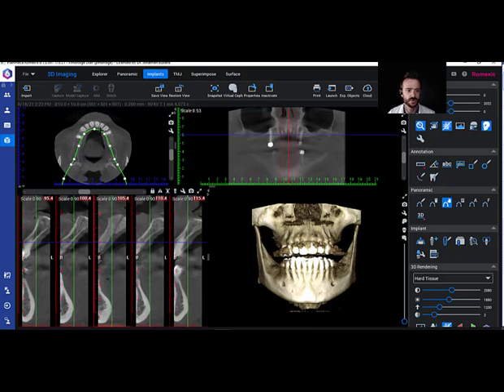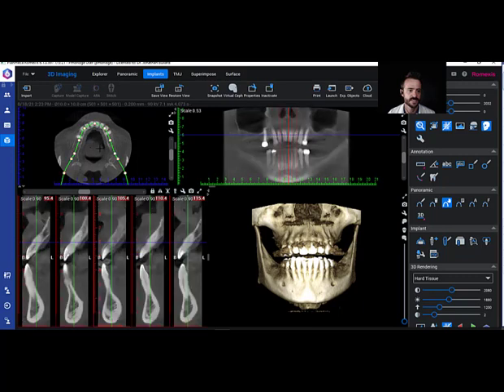We're going to grab the green line with the plus sign here, and then slide it right up — in this case it lines right up with the arch. Then we can look over on the upper right, which is the panoramic view, and we can see it's coming in more clearly.